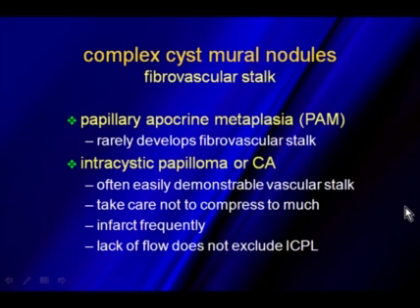Now, one thing is, anytime you're looking for the presence of blood flow in the breast, you need to make sure that you scan with very light pressure. Just the weight of your hand compressing on the transducer is enough to temporarily ablate the flow. So you do want to make sure you scan with light pressure if you're looking for blood flow.